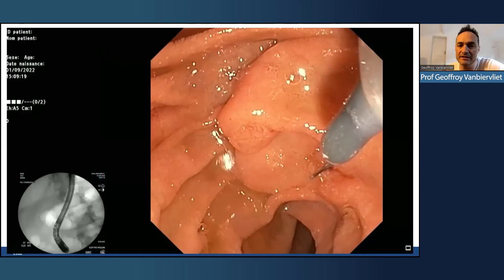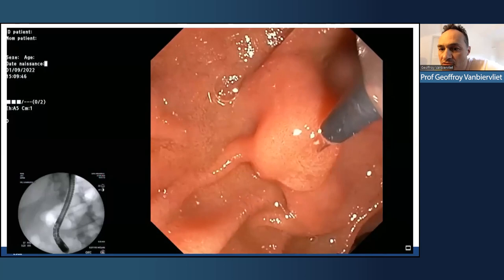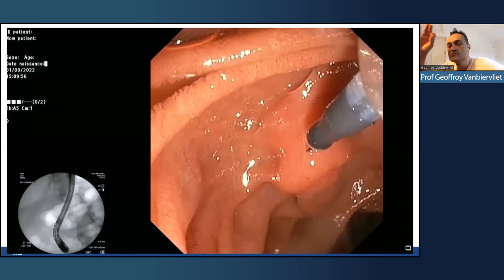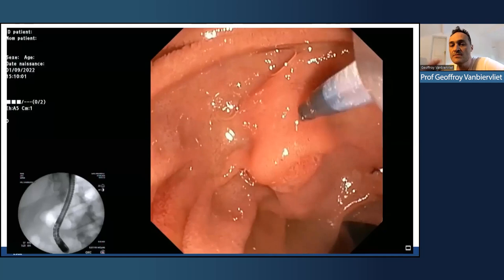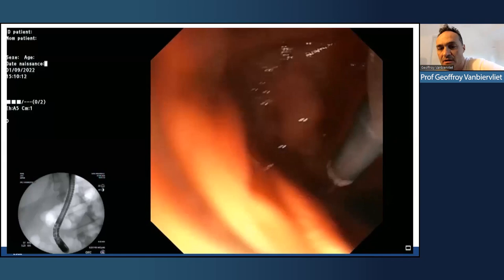Here, it was a second case. It was a stricture of the common bile duct due to a cephalic pancreatic tumor. And I show you the different way to perform the free hands technique after failure to access the common bile duct. And here it is the orientation and the right position to perform the fistulotomy, just up to the papilla inside the common bile duct sphincter, the bile part of the sphincter of the papilla of the ampulla.